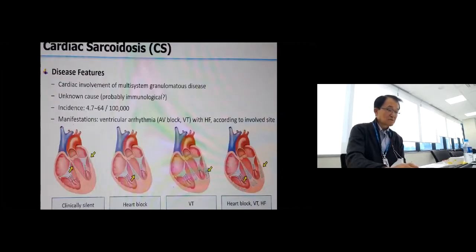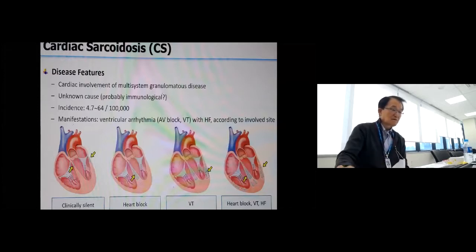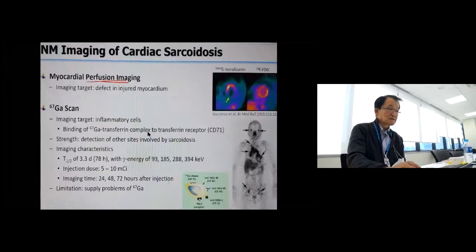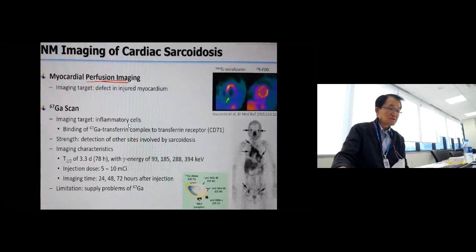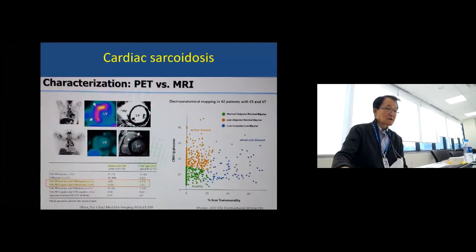And cardiac sarcoid is another problem in the United States, a granulomatous systemic disease affecting the heart, either causing heart block or ventricular tachycardia, sometimes clinically silent. Now using either perfusion defect, FDG fills the defect by inflammatory, particularly macrophage cells. MR also uses a non-specific delayed contrast enhancement. That's usually related to a fibrotic process.